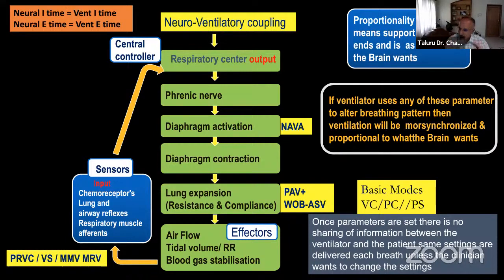So all the advanced modes are based on only two modes, pressure support and pressure control. So once you understand pressure support and pressure control, you can boldly say that I know all the modes. It is just understanding the application, how somebody has produced a target, and then he has made, with nanotechnology, artificial intelligence, a looping where the information is gathered, and according to the information, the tidal volume or whatever, the pressures change. So that is how the advanced modes are.